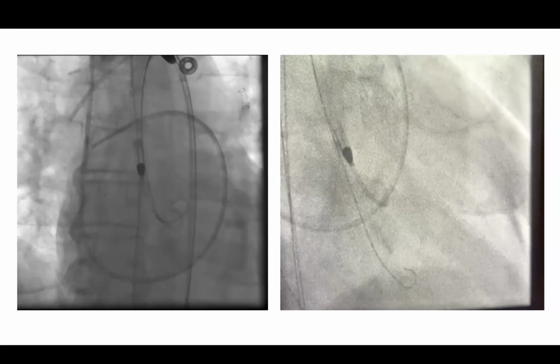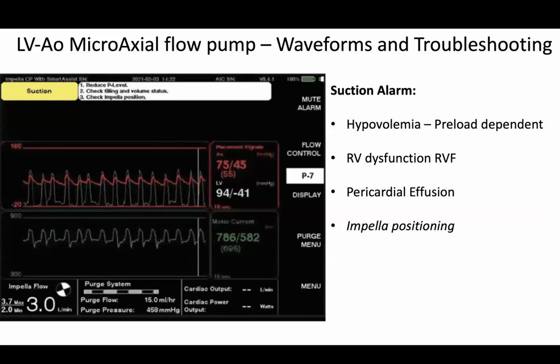The couple of snares that I was involved with, it took us a while. So that makes you wonder, do we really need the support? Because if you're stable there for an hour and a half, well, you snared these things, and then it becomes an ego battle. But I don't know. I think it's a neat technique. I remember one of those that we just couldn't get, and just put another Impella in. That's like the dreaded combo.